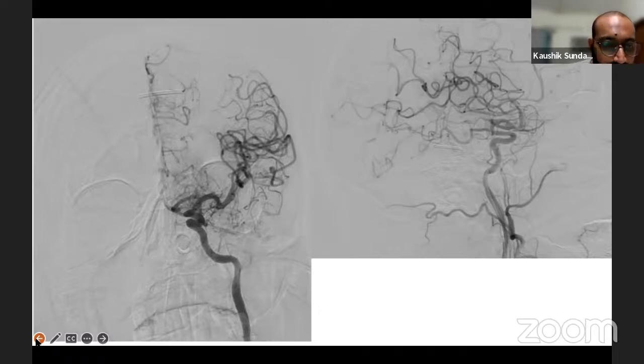Coming back to this MCA, Dr. Vishal, you did see this patient having a distal ICA occlusion. Of course, the ACA is being filled from the right side. That is why you are not getting an ACA territory infarct. In MCA, why was the entire territory not involved? That is also because of the collaterals, correct? But did you see the divisions that are involved?